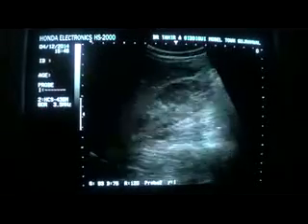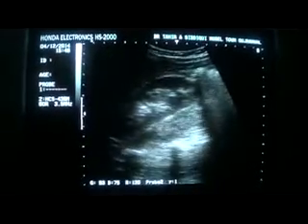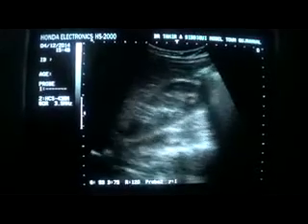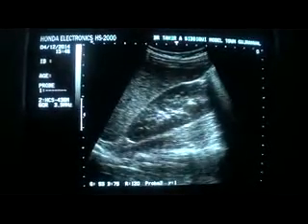Now you see, ask the patient to take a deep breath, hold it, and then freeze the image.